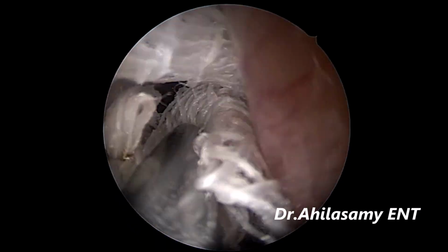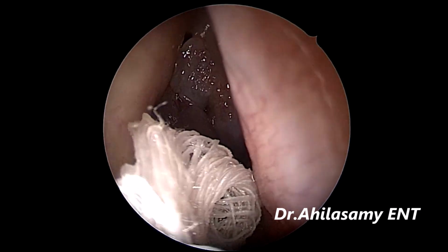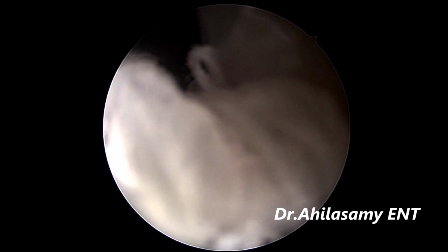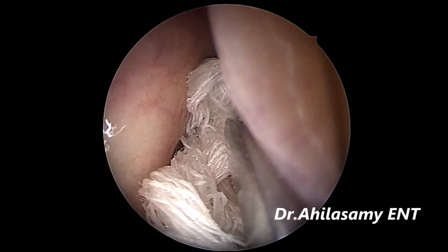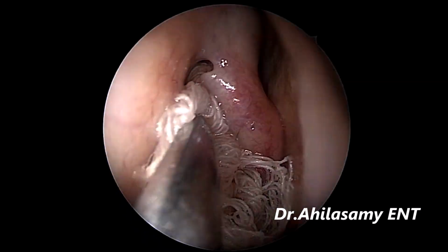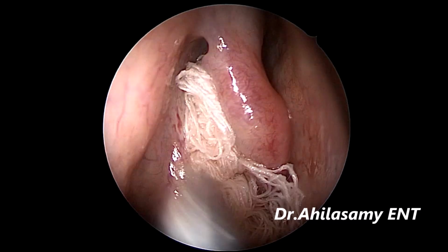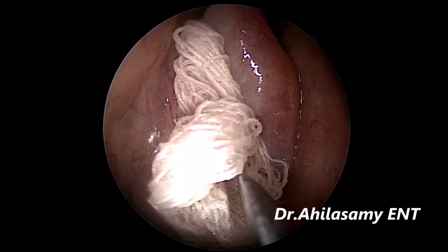This is a 76-year-old male patient, without much comorbid condition. I am taking under local anesthesia. Pack very well into the crevices repeatedly to get a good decongestion so that you can give a sphenopalatine block. If you don't get a good decongestion, then you go for a greater palatine block.